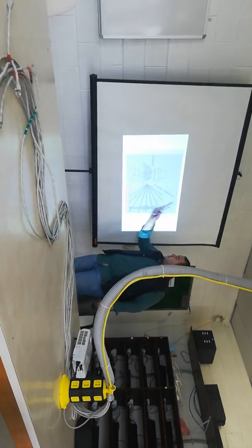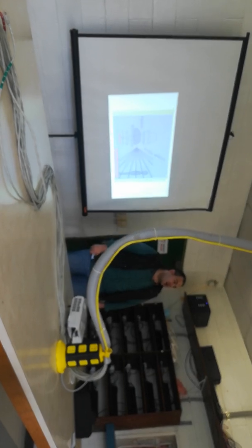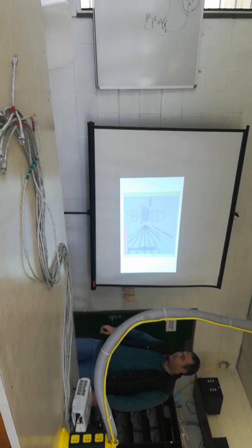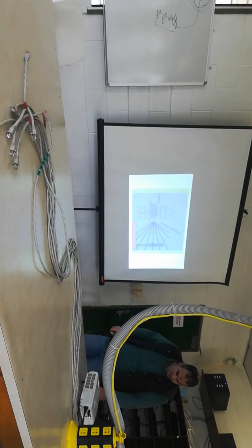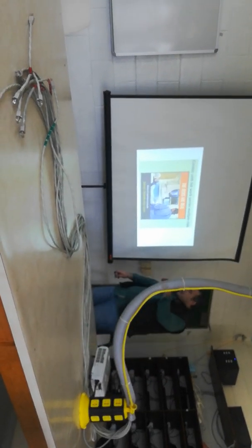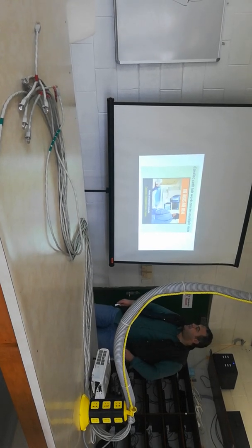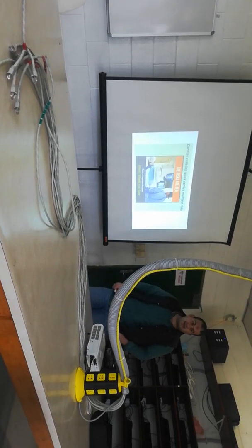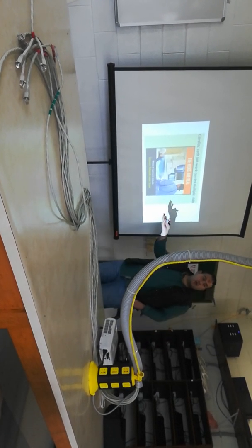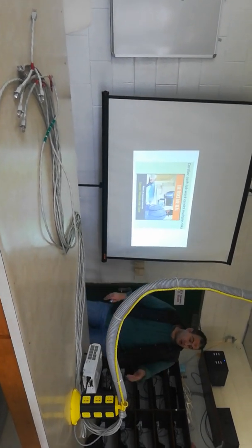The source of hazard will be scattered radiation coming from the patient. So how to protect myself from scattered radiation? The risks of exposure to scattered radiation coming from the patient are cataract, orthopedic strain, or cancer. These are the problems which may happen in fluoroscopy or the operating theater.